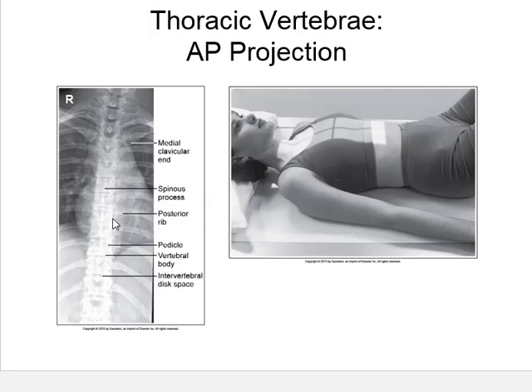And before we started using the computer algorithm, it became very important to utilize the anode heel effect. And it might still play a role, and it's still certainly a testable thing, but it's probably not as important as what it was whenever we used screens of films. And as a matter of fact, compensating filters were almost essential if you had a patient who had any kind of size to them at all on screens of films.